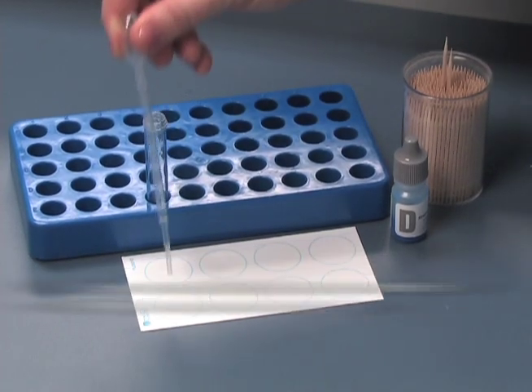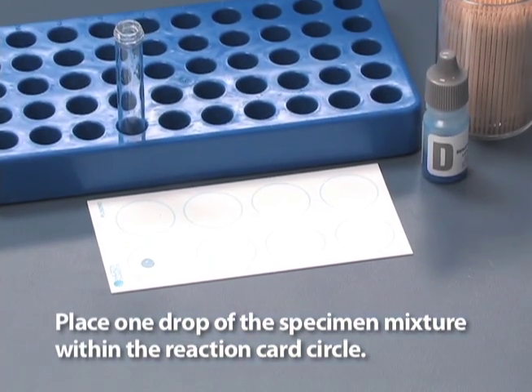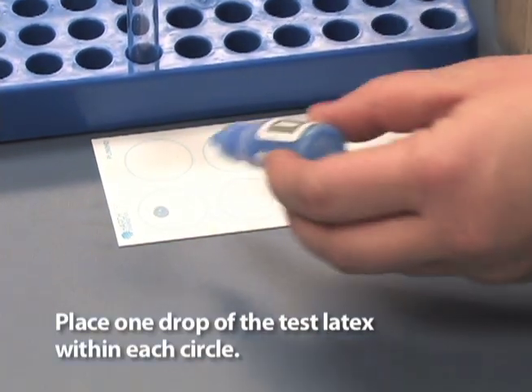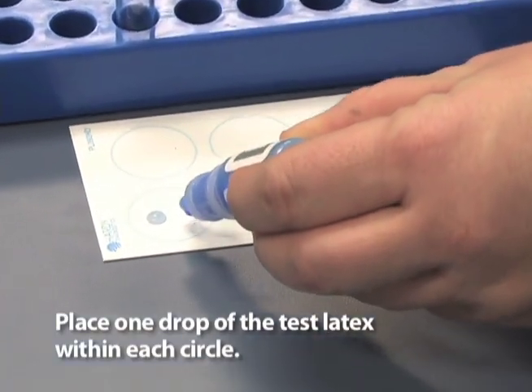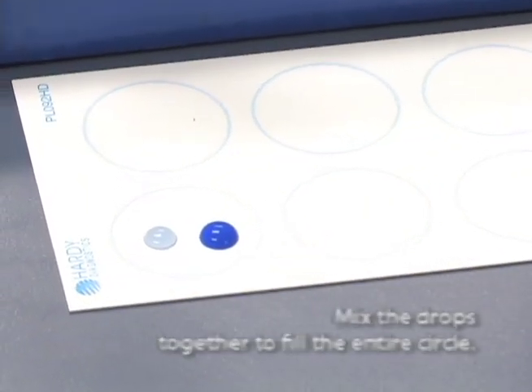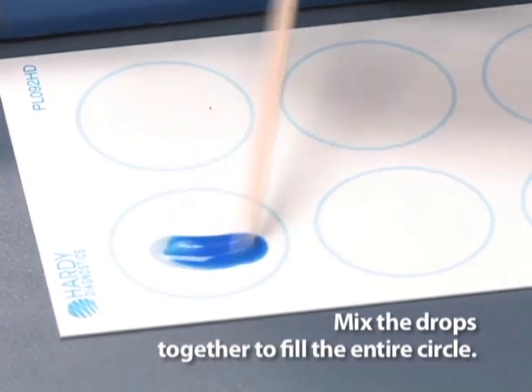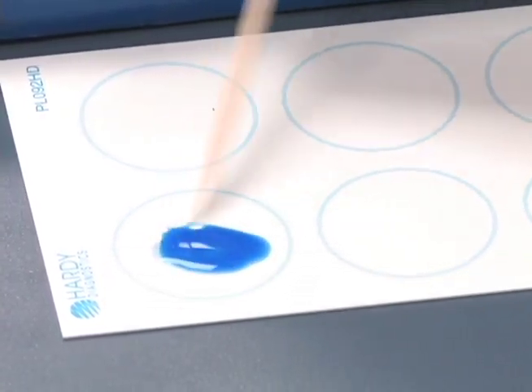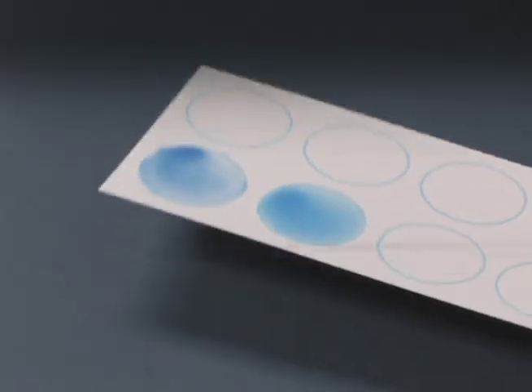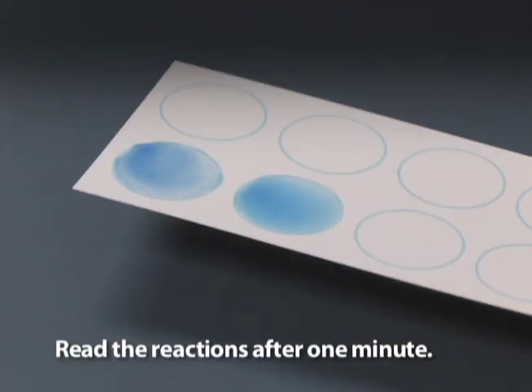Place one drop of the specimen mixture within the reaction card circle. Now place one drop of the test latex within each circle. Mix the drops together to fill the entire circle. Rock the card back and forth. Read the reactions after one minute.